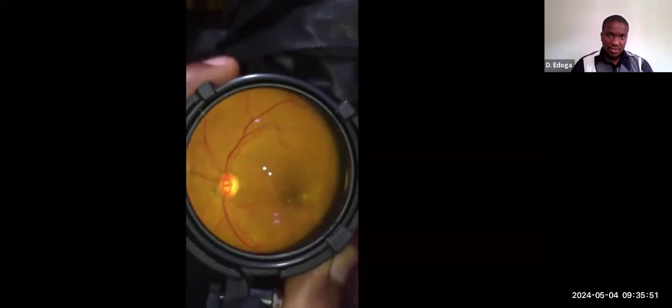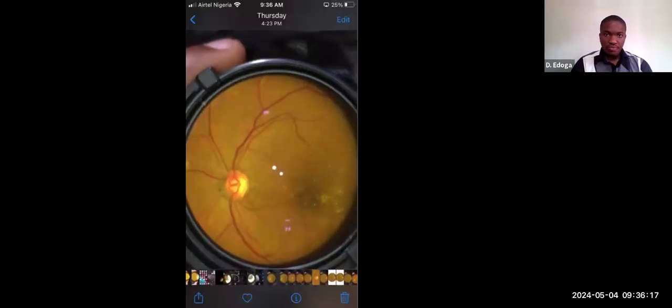Okay, so we have this. If I continue to slide, and I'm happy with this, I take a screenshot. To take a screenshot with older models of iPhone, you combine the center button with the power button. So I'll just do it now. I'll click on the screen and then. So I've taken a screenshot. The screenshot will be stored. So I will show us the screenshots I took.